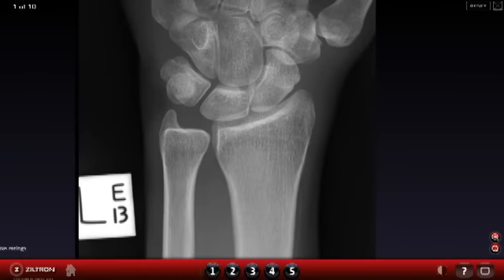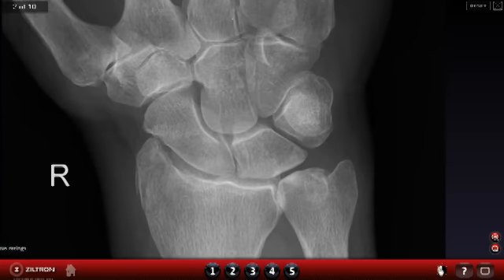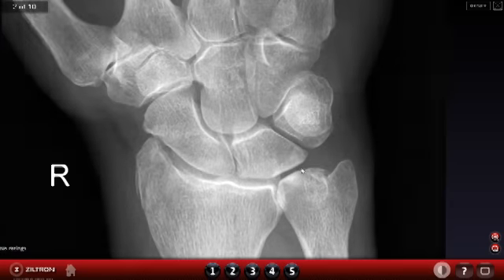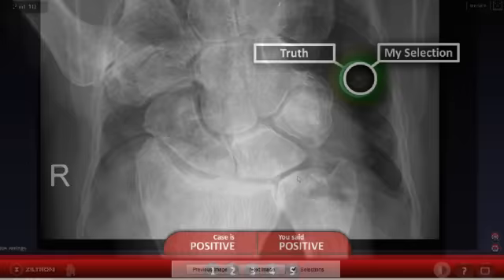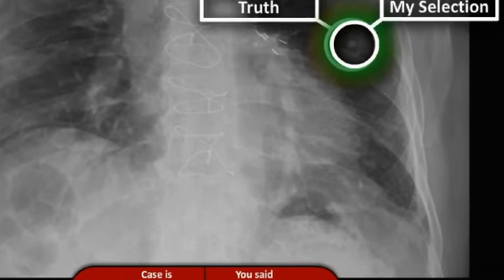Ziltron allows you to inspect images, scans, and videos straight from your browser with real-time zooming and windowing. You can mark locations and get precise, instant feedback on whether you got it right or wrong.